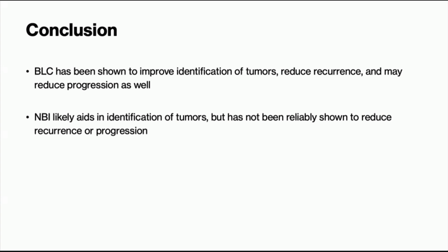Kind of similarly, NBI likely aids identifying tumors, but the overall impacts on outcomes are, I think, not as strong as that for blue light cysto, but it doesn't confer any additional costs. There are no documented risks associated with it. So there are many contexts in which perhaps you might as well try using NBI, because it could help you detect more lesions and it may improve your outcomes. And both of these have been guideline recommended.